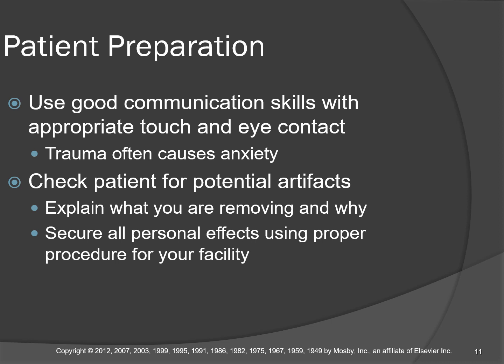Yeah, check the patient for potential artifacts. Oh yeah, I was describing our bad policy back in the day. If the patient doesn't have a friend or a family member to hand off to, we were to hand off to security. Okay. Either way, when you hand off stuff, make sure you're documenting it.